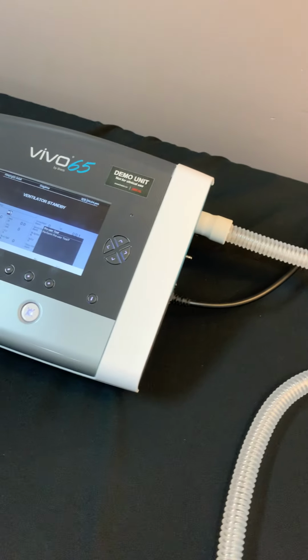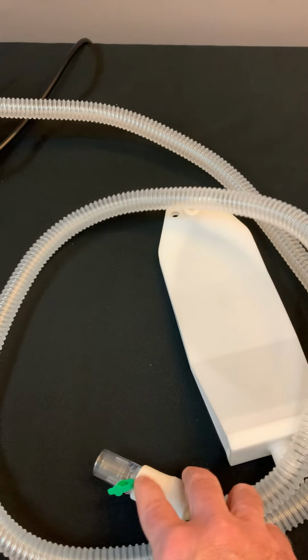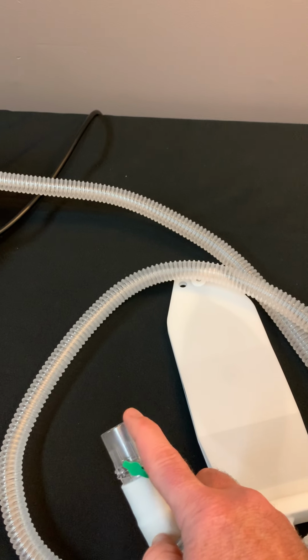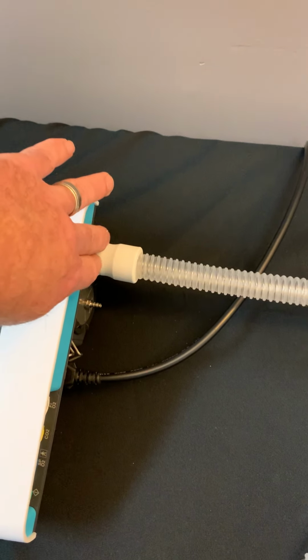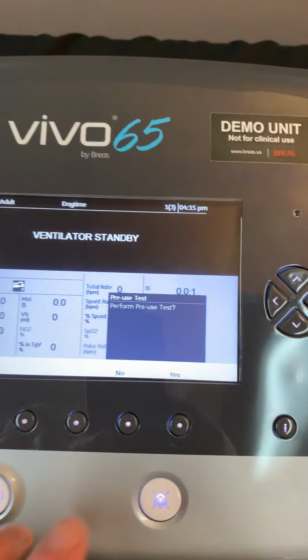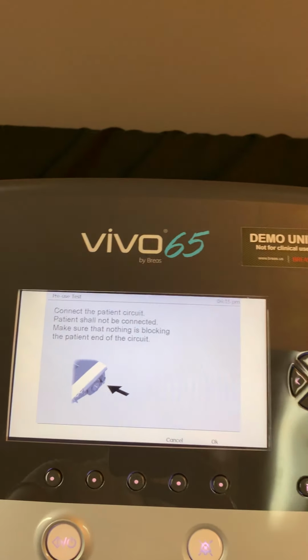So by doing that pre-use test procedure, it's going to compensate for that volume, which basically means that the 400 mLs that you're trying to deliver to the patient will be measured here where it connects to the patient, rather than back here where the circuit connects to the ventilator. Okay, so we're going to go ahead and click yes, we want to perform that pre-use test.